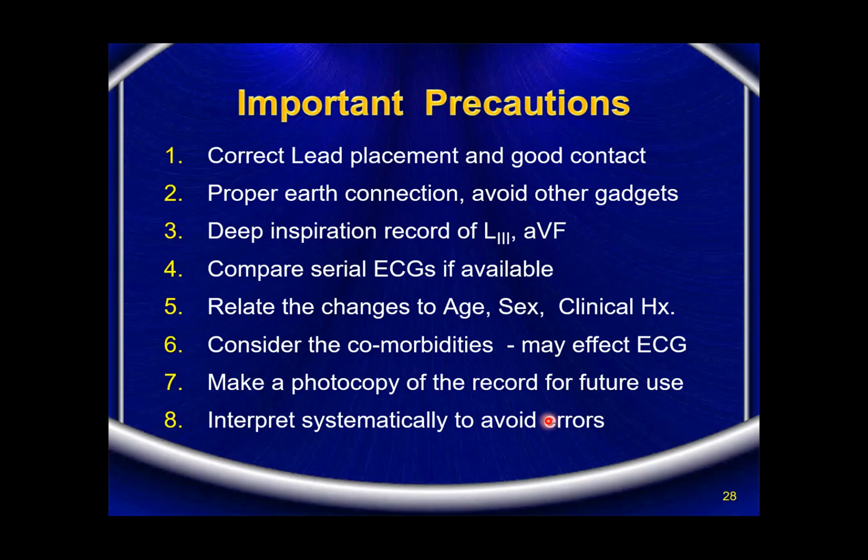Likewise, we use a gel-like substance, an electrojelly, which conducts the electricity to the metallic lead there. Particularly when the chest is hairy, you have to shave the hair and see that the skin comes into contact with the electrical lead through a jelly.